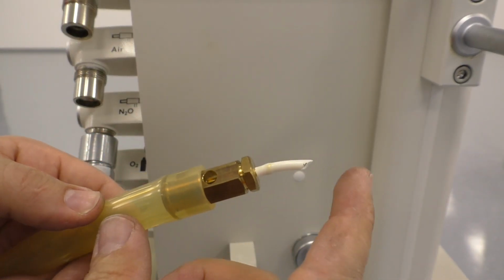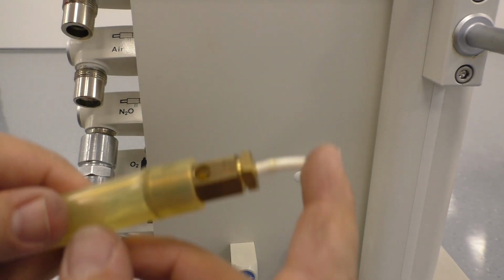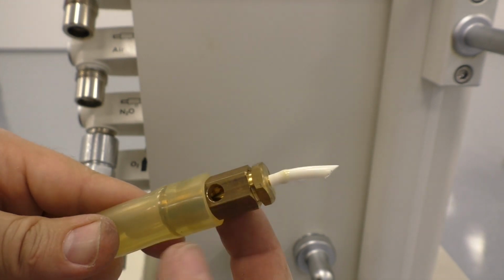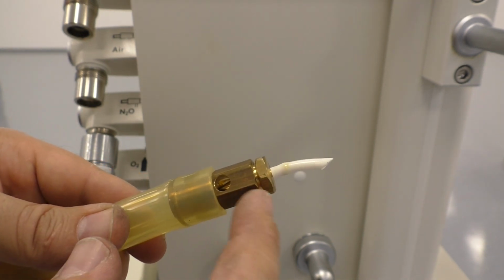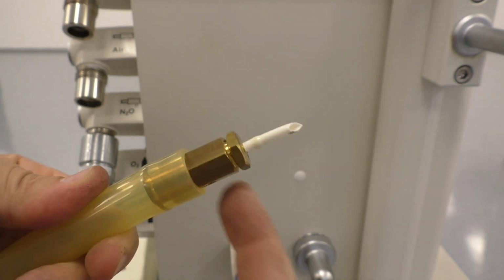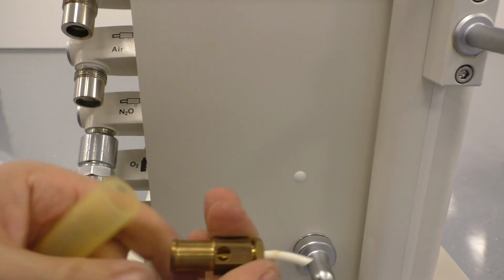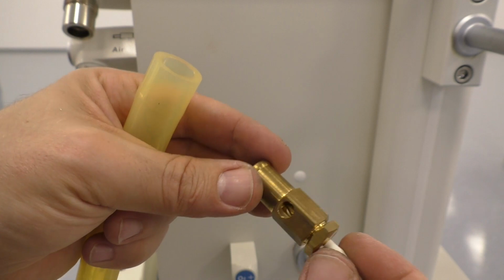That's a nice part. This is pressurized oxygen. Yes, white line oxygen. It has here a needle, a jet, some sort, and a big hole on each side. This acts like a venturi valve. It injects here pressurized oxygen, and then air goes in here and mixes together and goes through that hose here. So this is a venturi injector valve thing. Very nicely made.